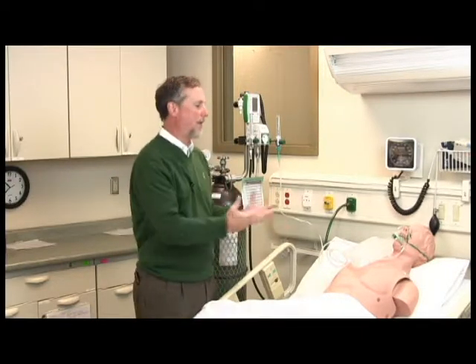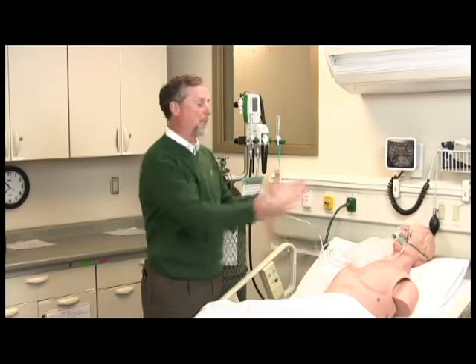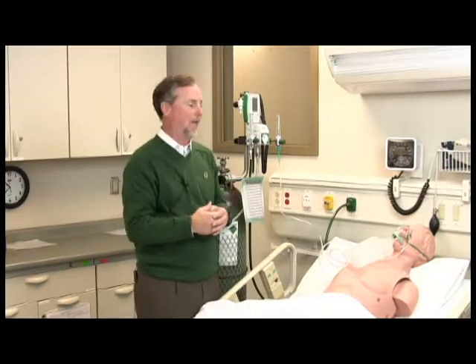Again, if you're doing Heliox therapy and the patient is just not responding, do not let the fact that Heliox therapy may or may not be effective stop you from progressing into what the patient truly needs. If the patient needs to be intubated or supported non-invasively, please move to that quickly and support the patient as necessary.